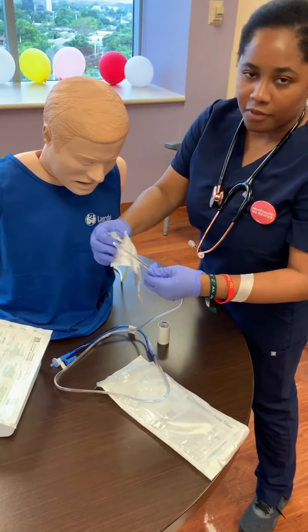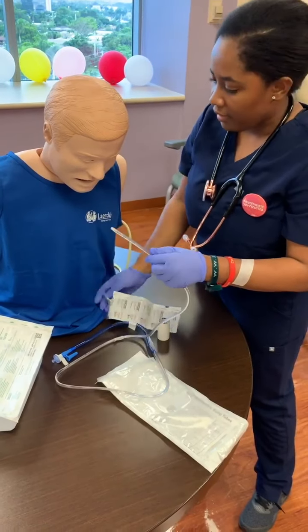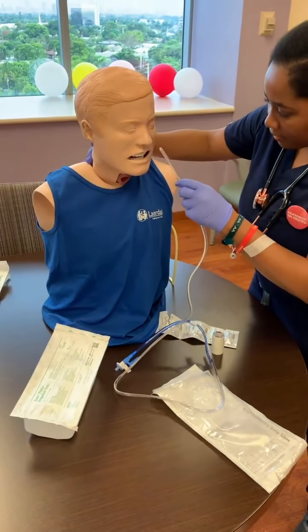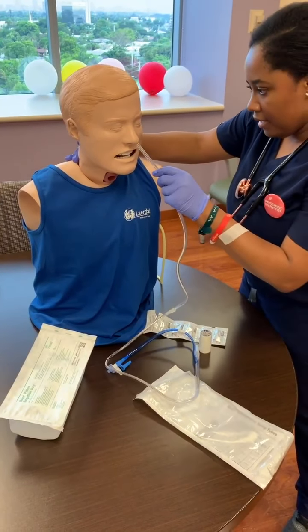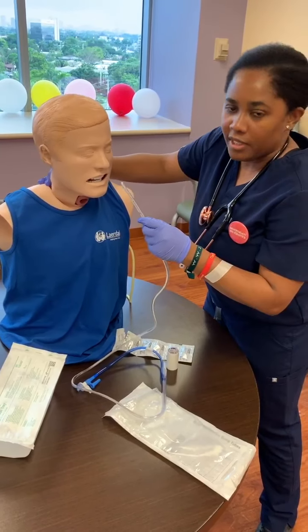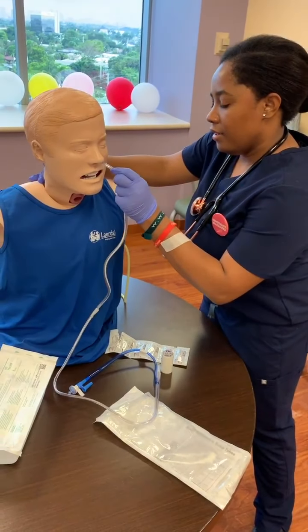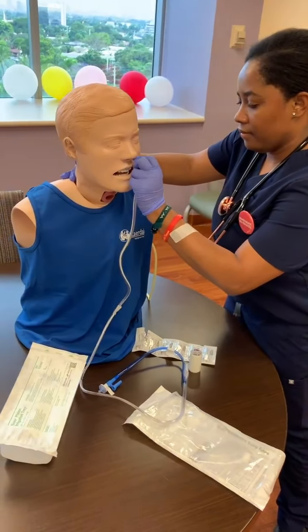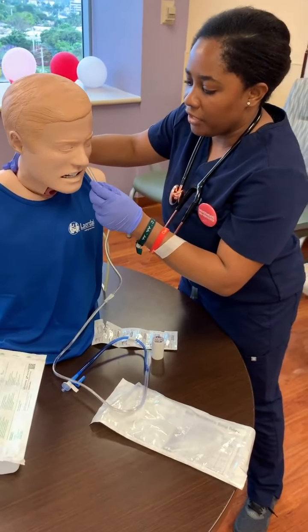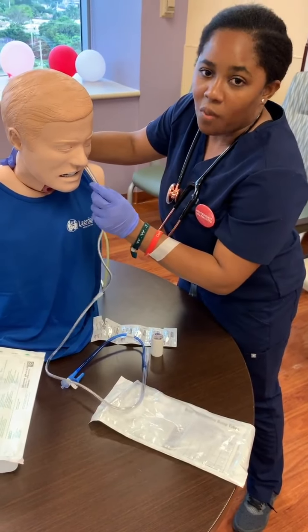This is a mannequin so I'm not really going to be putting lube in there, but of course we're going to apply the lube to the tip. Having the head up — if your patient is not able to support the head, you're going to have to really secure it for them. You're going to go down, and once it gets kind of behind the throat area, you're going to have them put their head down and have them swallow.